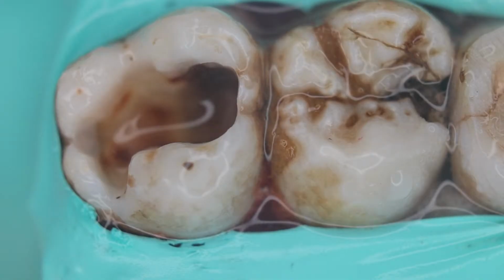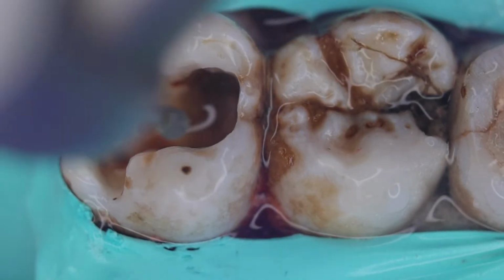Now coming to the last part, that is creating the flat floor for this cavity that we have designed.